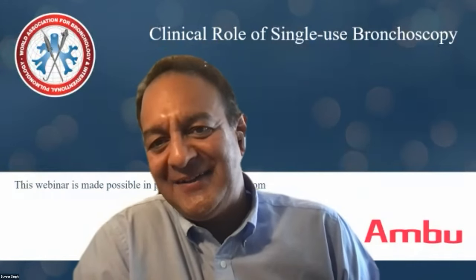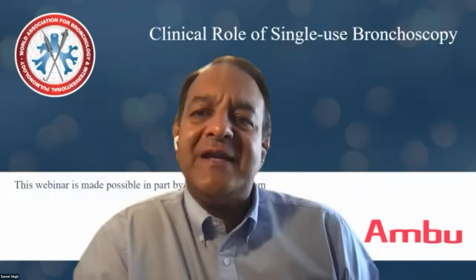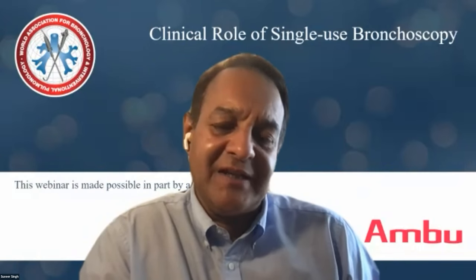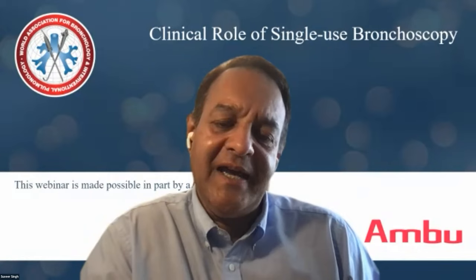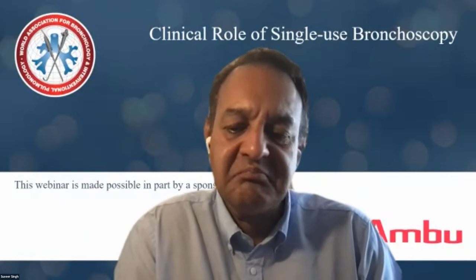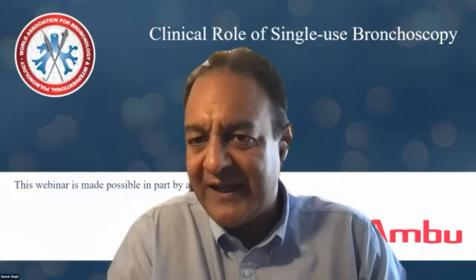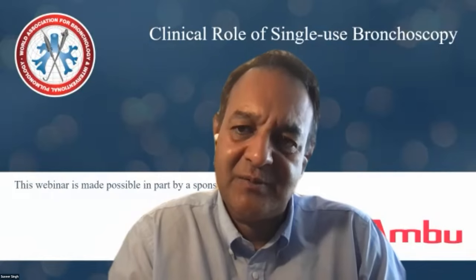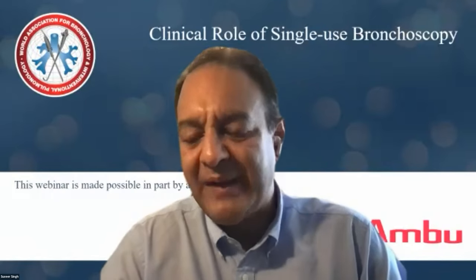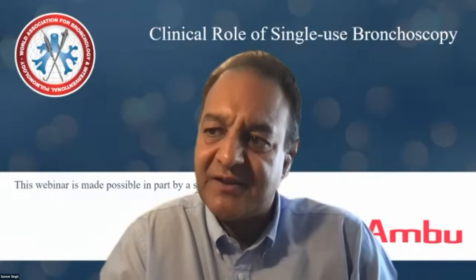Well, we're looking forward to hearing. And there was a question from Nihad Osman about how long you can keep one of these single-use scopes out and then reuse it. I think we would refer you, Nihad, to the conversation that we had earlier on. I don't think that they should be left out and reused. If this was a new tracheostomy, for instance, you may wish to flush it, wipe it, and keep it there for some minutes, an hour, in case there was a complication that you needed to deal with. But beyond that, and I can't give you an exact timeline, one just has to be aware that biofilm and accumulation of bacterial load is developing all the time. So remember, they are single use, not even single patient.